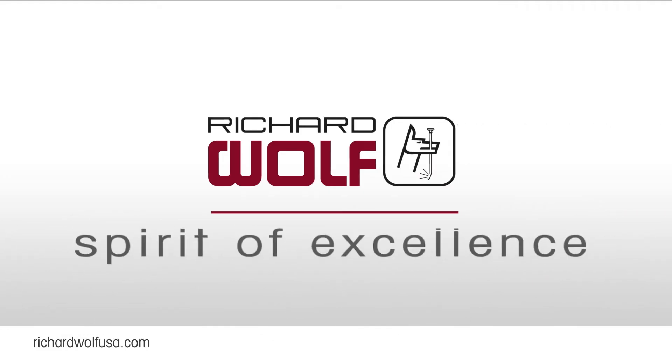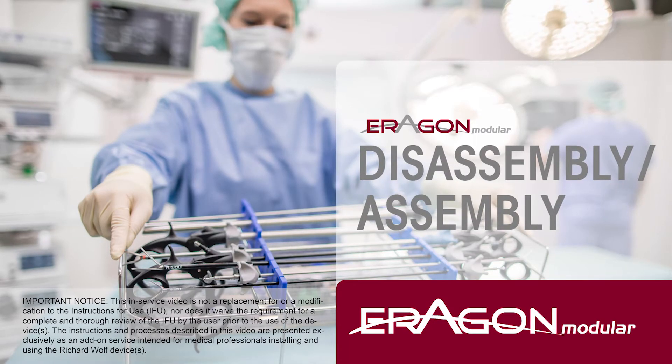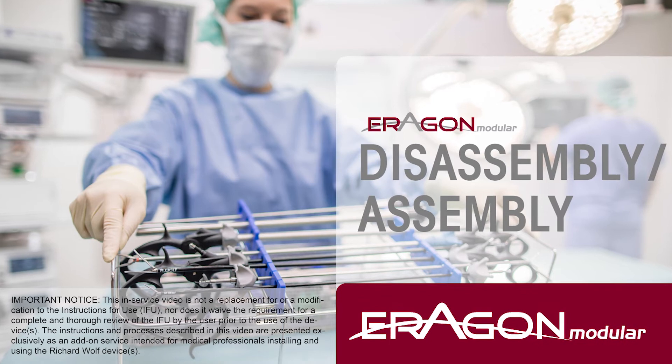Richard Wolf, Spirit of Excellence. Disassembly and assembly of ERAGON Modular and ERAGON Modular Mini Instruments.